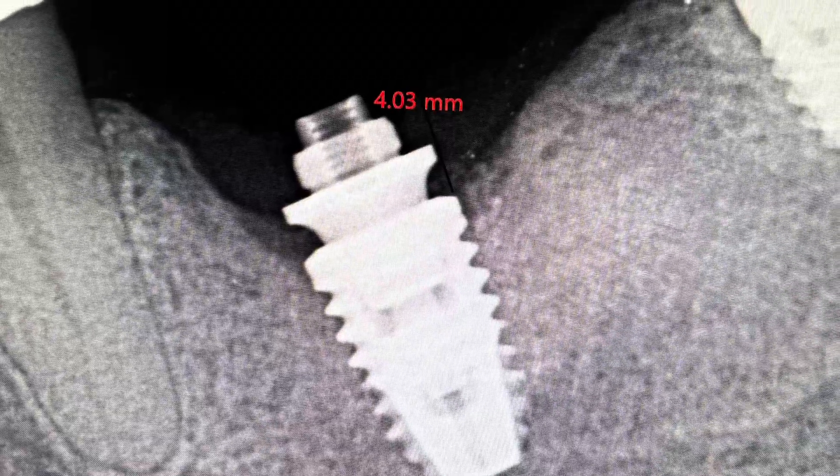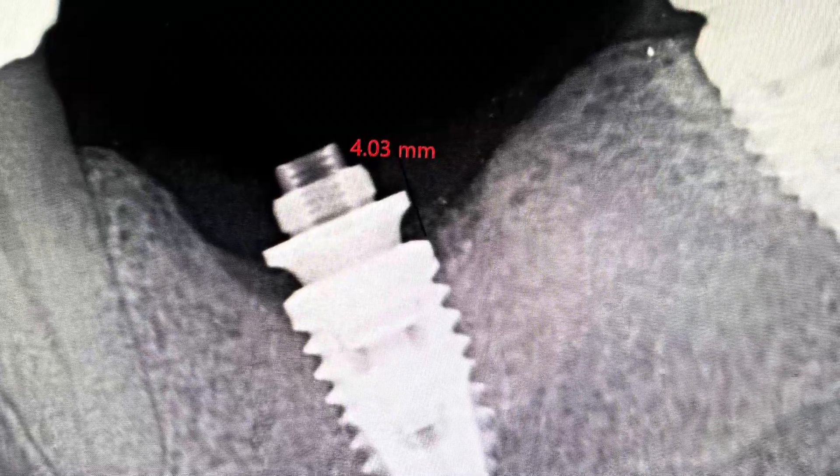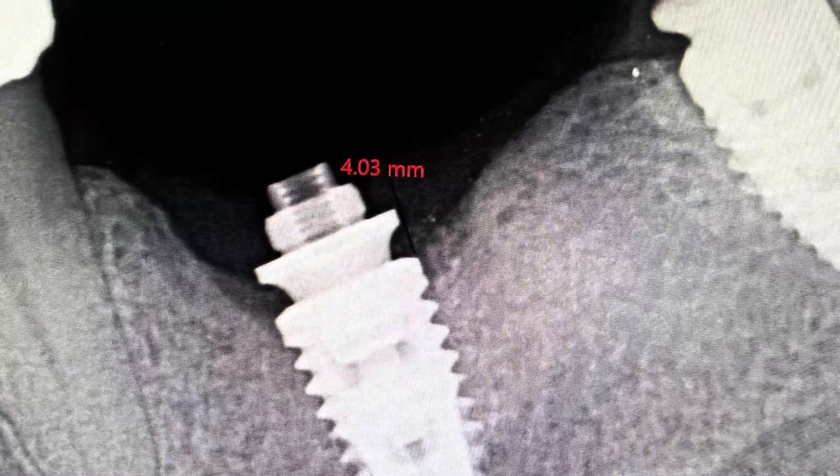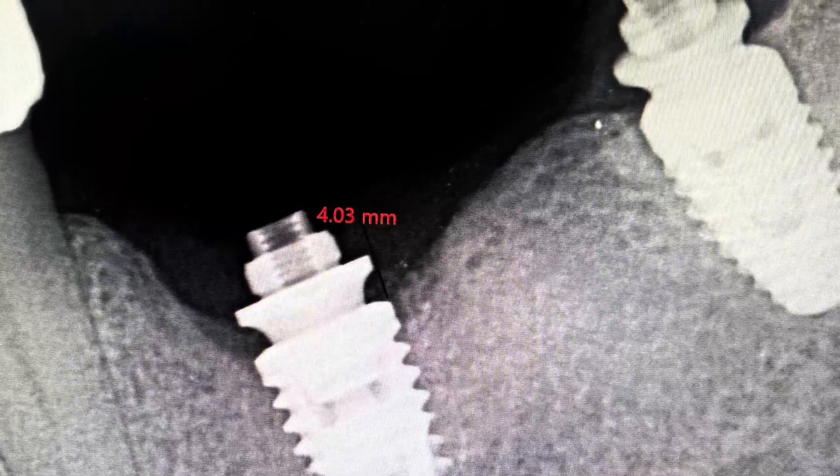We took an X-ray to show that we have about four millimeters from the zenith of the soft tissue to the platform. We want the platform shift to be protected with this vertical soft tissue, and this is what's going to make the bridge long-term successful.